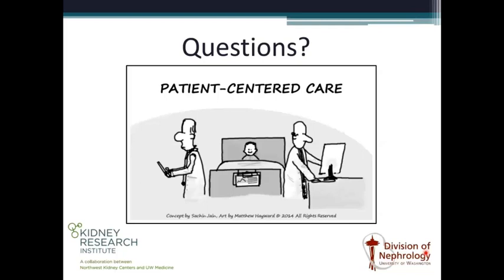The practical aspects are challenging. Right now at Harborview, there is no way for a primary care provider, for example, to order an ambulatory blood pressure monitor. In the hypertension clinic, we have 4 monitors. I've heard that you guys just got 2. And these are really being used for patients in my clinic that are referred for complex or resistant hypertension.